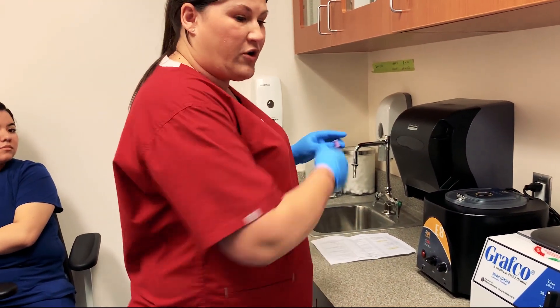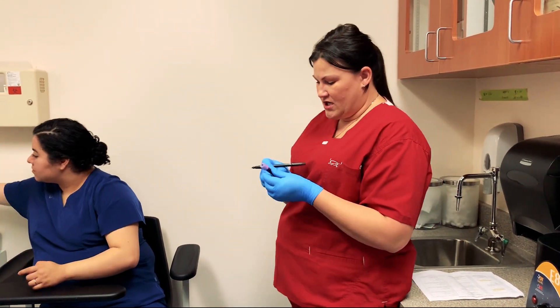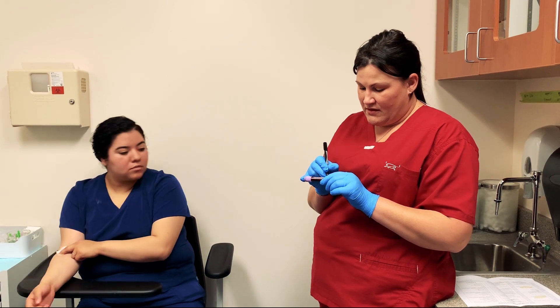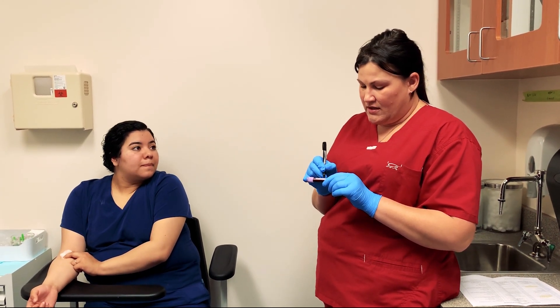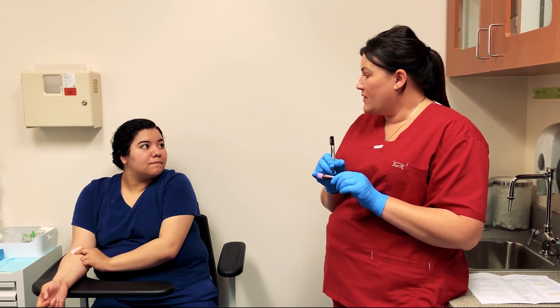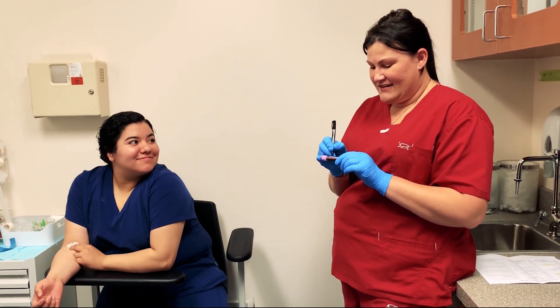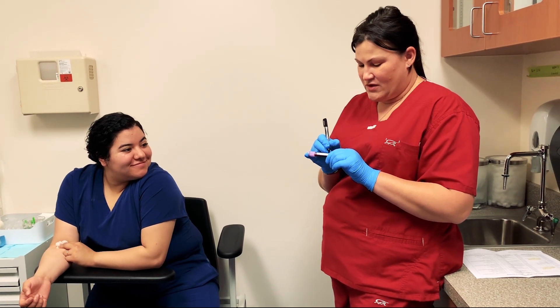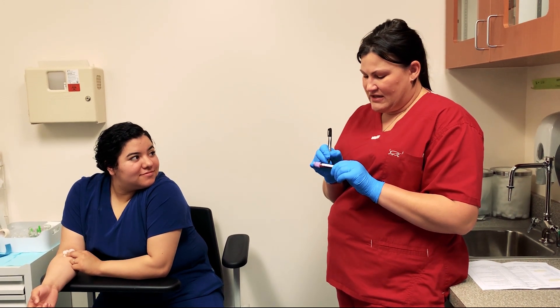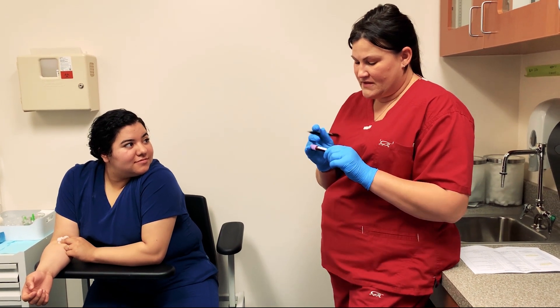So the first thing you want to do before your patient leaves is to make sure that it is appropriately labeled with your patient's name and date of birth. Her date of birth is 2-14-2000, today's date is 1-8-2019, and then my initials — and I think that's it.